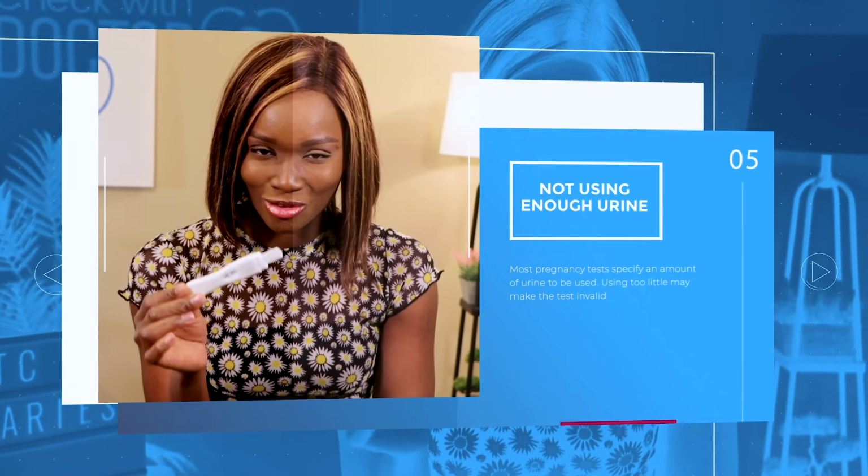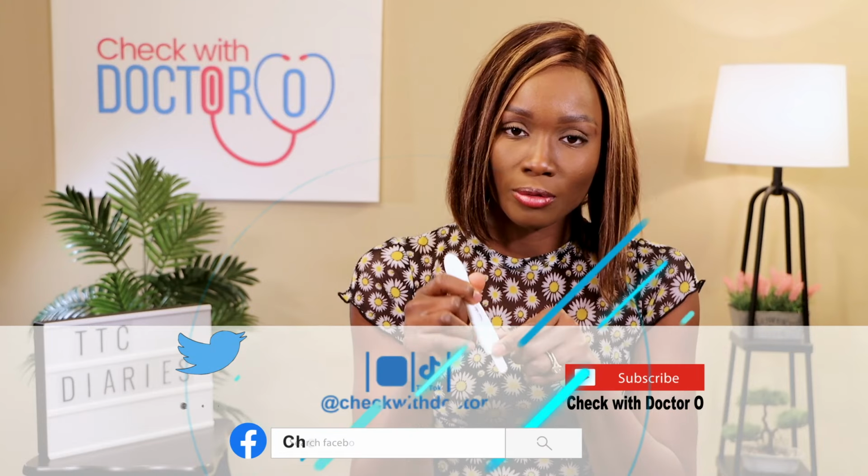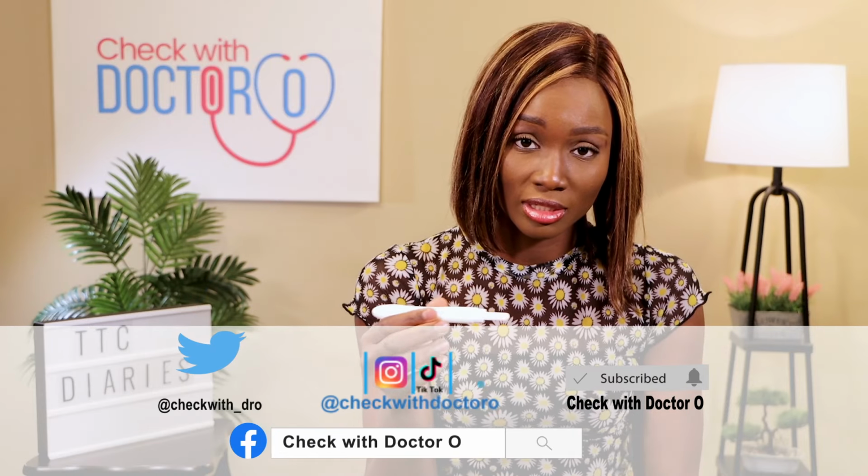Another mistake pregnant women make is not using enough urine to do the test. It's like you're missing the urine, or you're scared to use your urine sample, right? Especially for the ones where you're going to dip the strip into the urine. You need adequate urine sample for the urine to be absorbed all the way to the top of the strip. So make sure that you are using the recommended amount of urine on the pregnancy test kit instructions, or at least use adequate amount of urine, right?